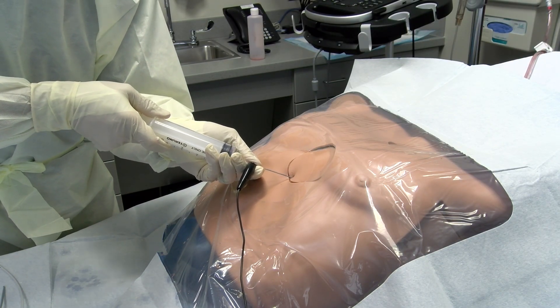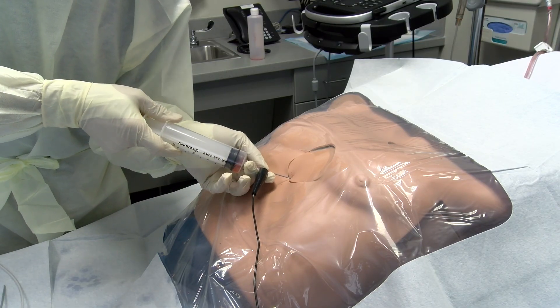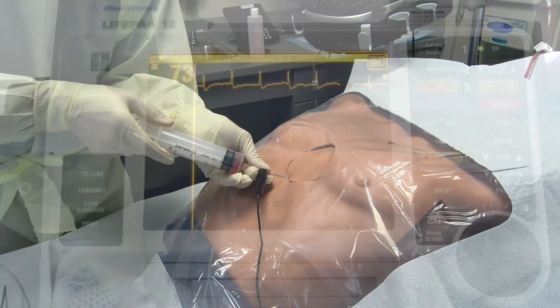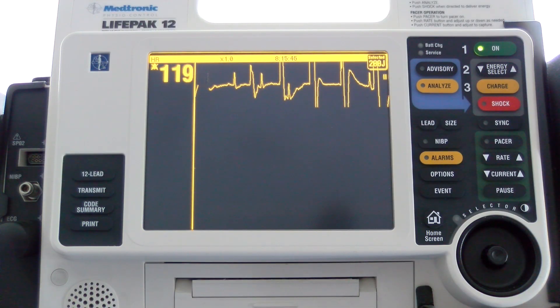In addition to connecting the EKG lead to the needle, the monitor must be adjusted to display this lead. This lead should be monitored continuously during insertion to identify the current of injury, which would indicate that the needle has penetrated the myocardium.